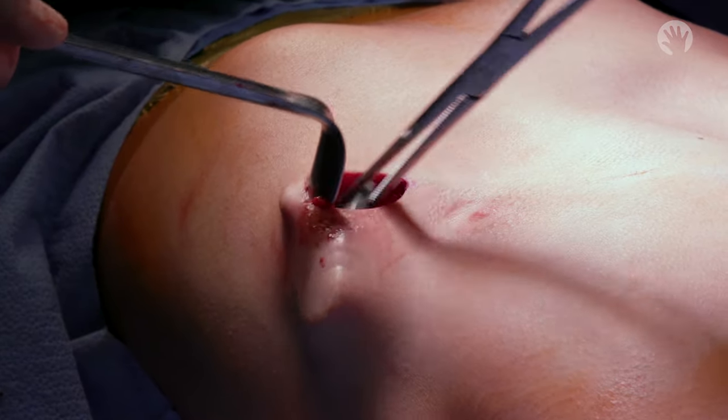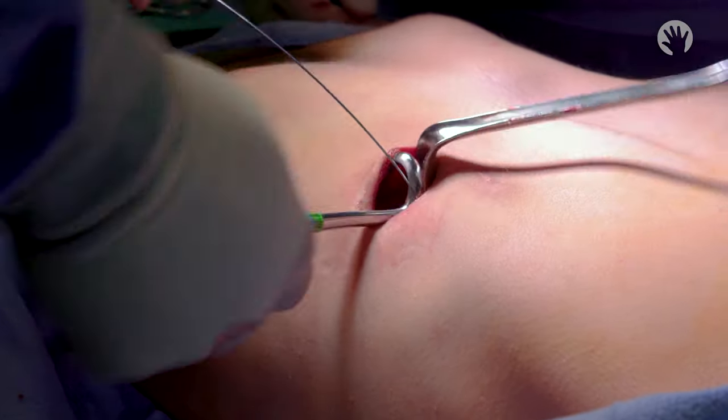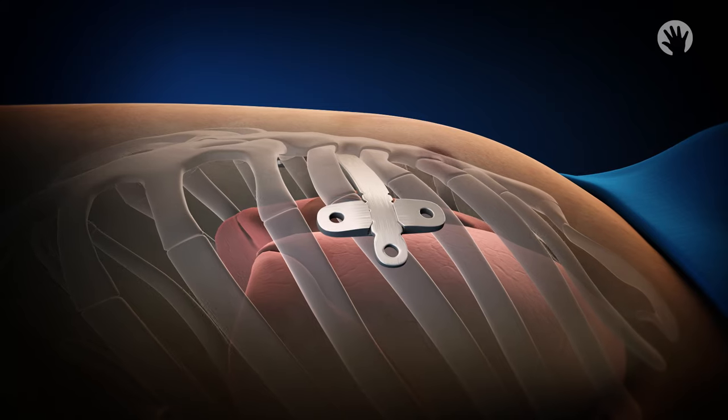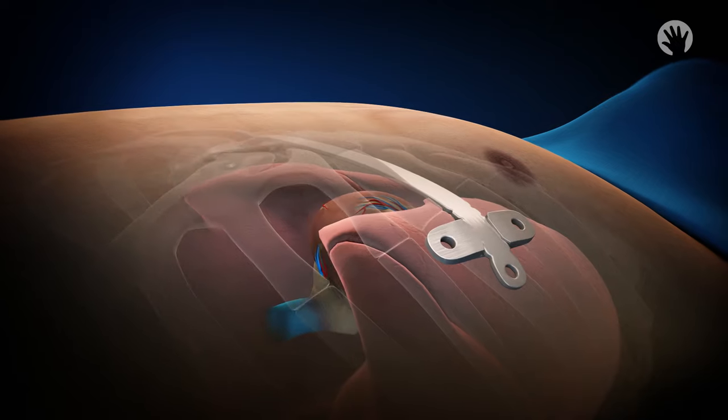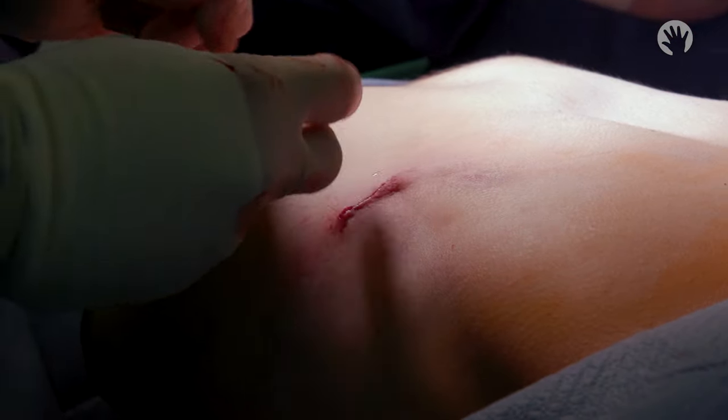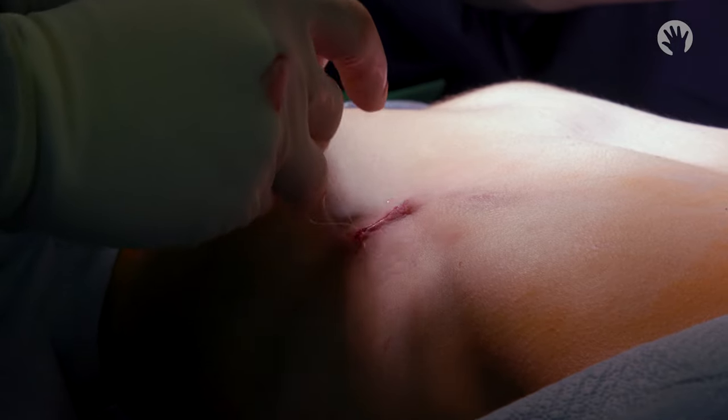Stabilizers are mounted onto the bar and the bar is wired to the ribs to prevent displacement. As the procedure wraps up, air is evacuated from the chest and the lungs are reinflated. We close the incision and the operation is complete.